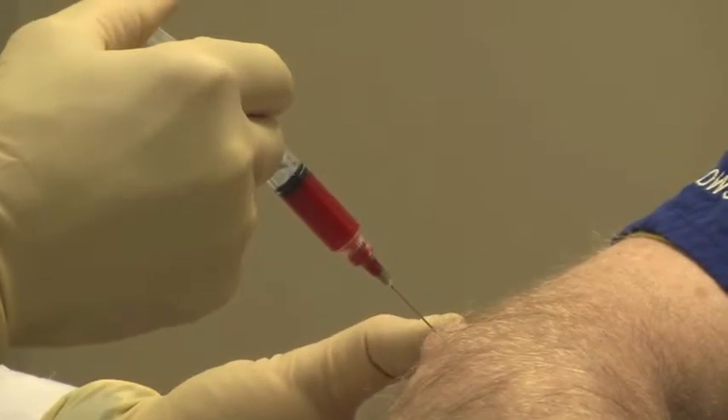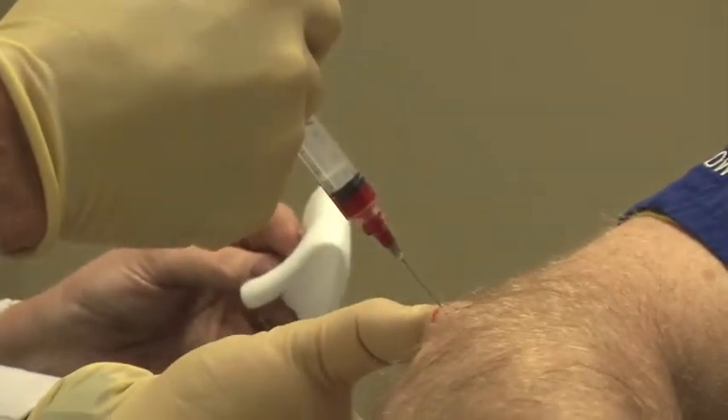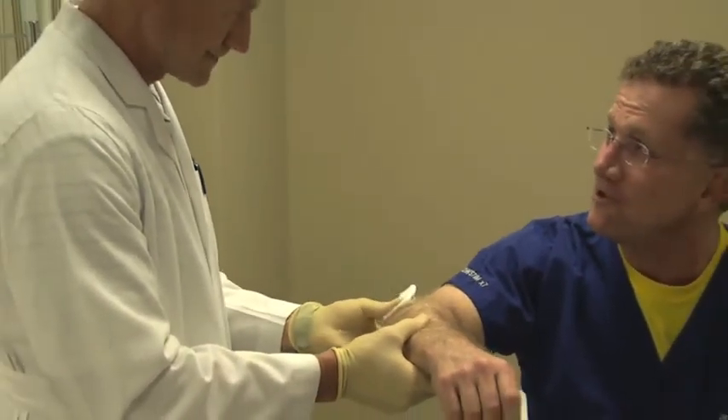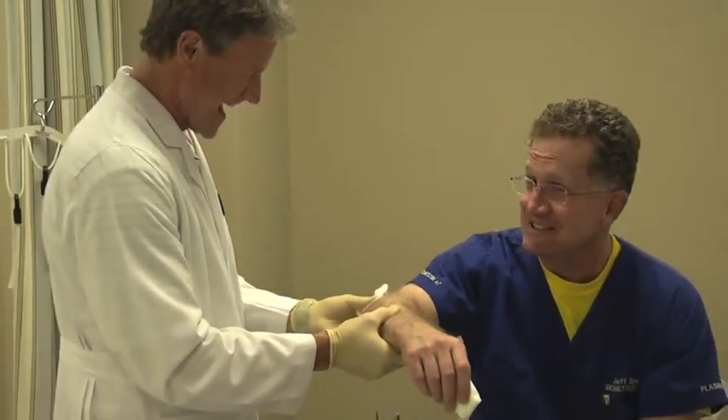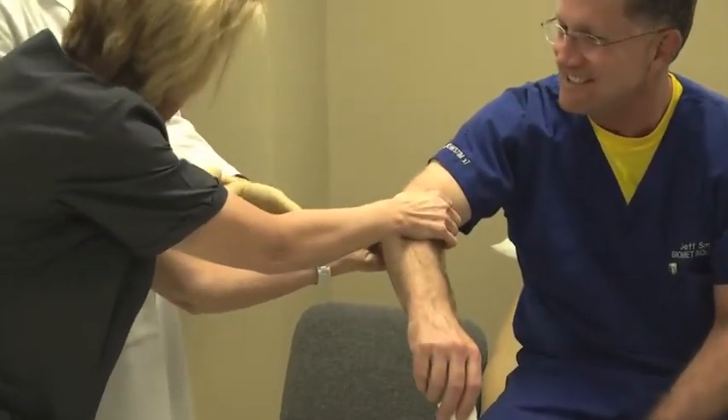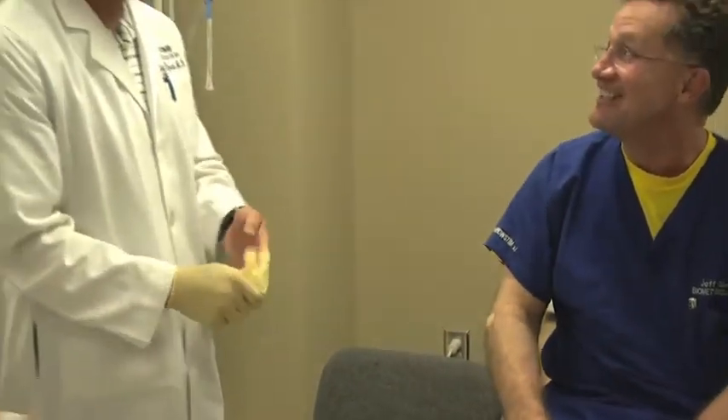Finally, we'll inject our PRP directly into the tendon area. Once we have it injected, we'll massage it in, place a band-aid over the area, and the patient's ready to leave.